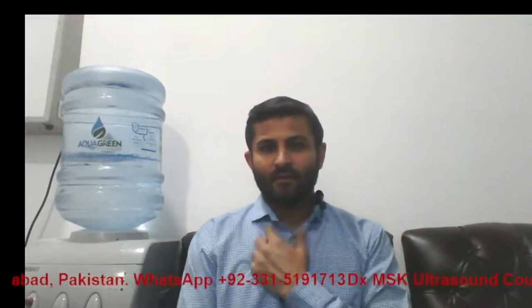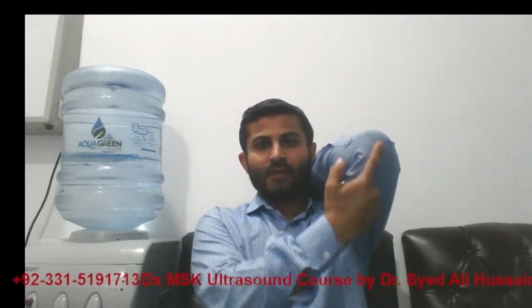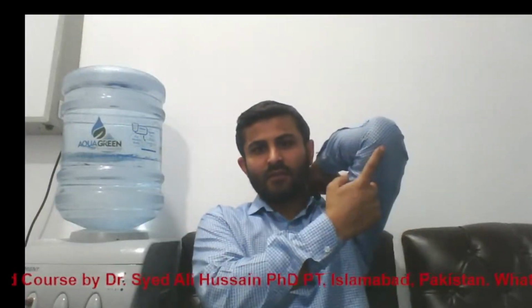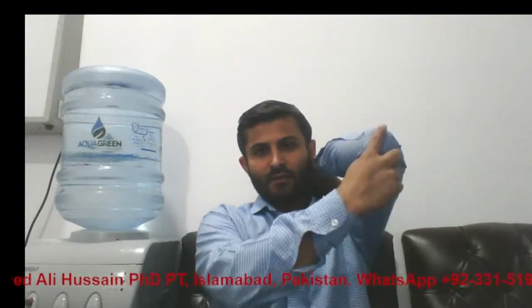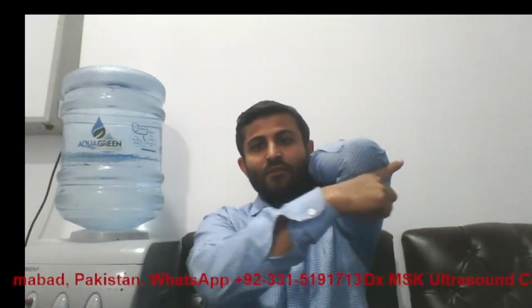You can take any tendon. For example, you can take the tendon of the triceps. So this is the tendon of the triceps. If you keep it relaxed and now scan it, it will give you anisotropy. So you need to stretch it and then place the transducer. This is the long axis because this is the longest dimension of the triceps. And if you cut it from this side, that will be the short axis.